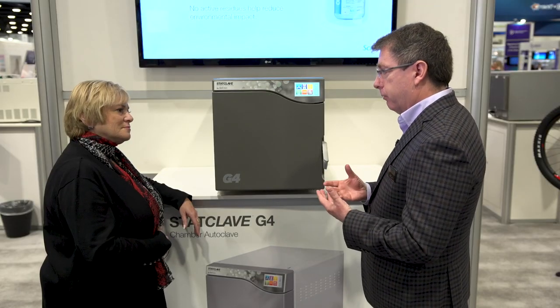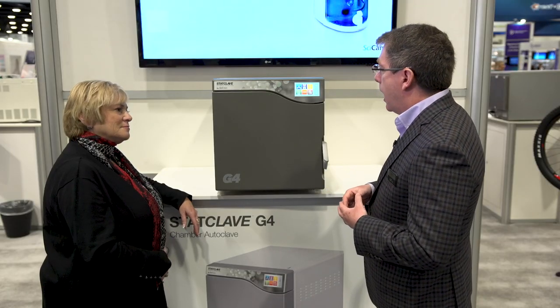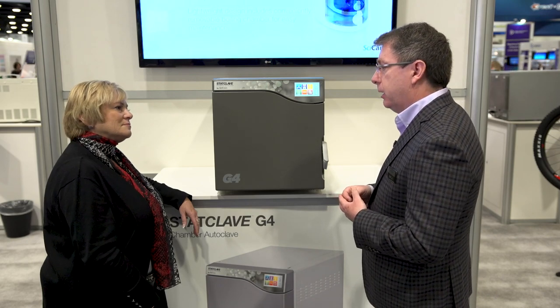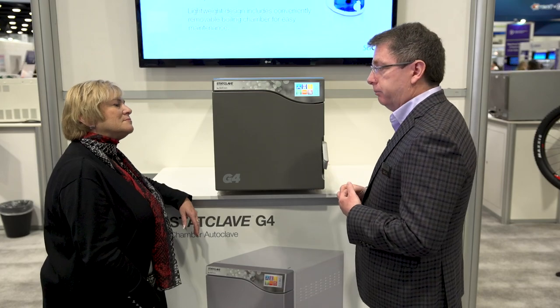Because it's electronic, we have a lot of functionality. One thing that's been very exciting for people is the ability to program a time to start the cycle. So at the end of the day, they can put a load in and tell it to start at seven o'clock in the morning. Then when they arrive at eight o'clock, it has just completed its cycle and you've got fresh, sterile instruments.